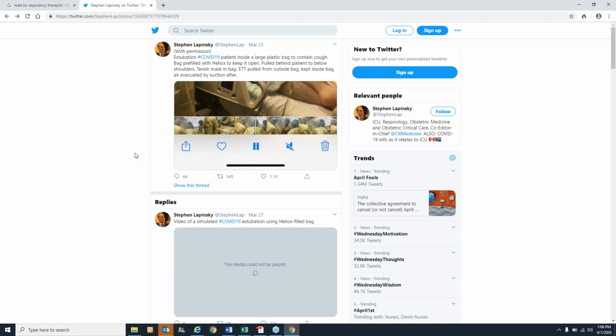We decided to just manually ventilate, ensuring that there is a filter between the ETT and the BVM, just because using a transport ventilator is another piece of equipment and another disconnect. So we elected not to use a transport vent. And then we follow whatever policy we have from IPAC in terms of having a dedicated elevator, and having the hallway and the elevator, everything, wiped down post-transfer. That's sort of what we were looking at. I don't know if that answers the question fully.